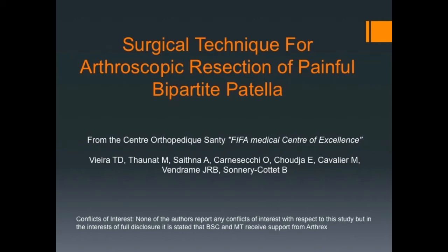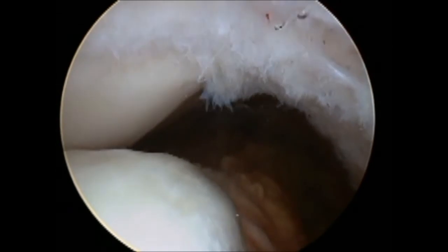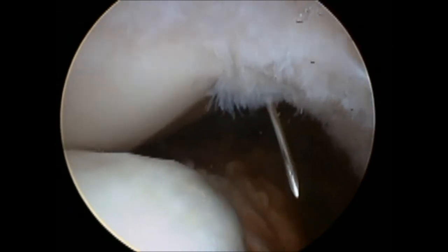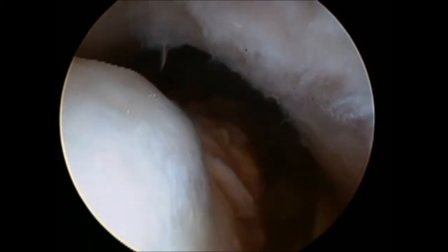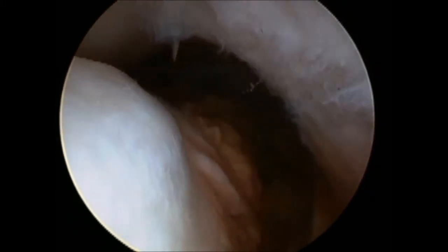When the camera is inserted, the light lead is rotated to look up towards the patella. With the knee in full extension, the synchondrosis is localised using a needle. This can be assisted with the use of an image intensifier if necessary.